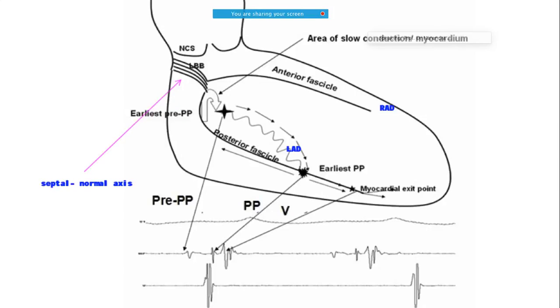is the pre-Purkinje potential, as seen in the accompanying electrogram, which we can see in the lower portion of the figure. And the lower turnaround side of the re-entrant circuit occurs in the lower third of the septum with the capture of the fast-conduction Purkinje fibers along the posterior fascicle. From here, the antegrade activation occurs down the septum to break through the septal myocardium below, and the retrograde activation occurs over the posterior fascicle from apical to basal septum, forming the retrograde limb of the tachycardia.